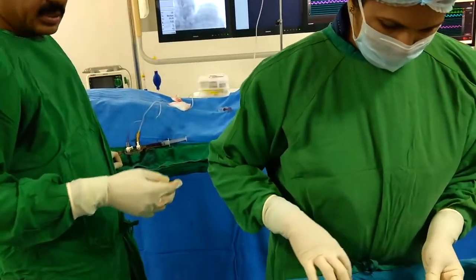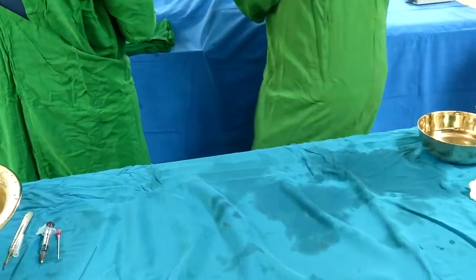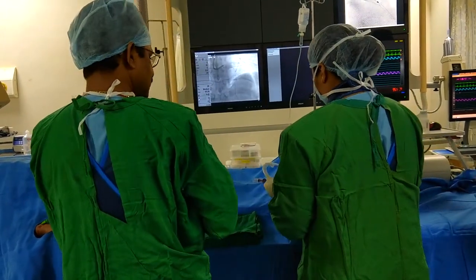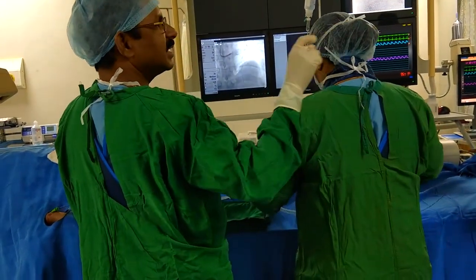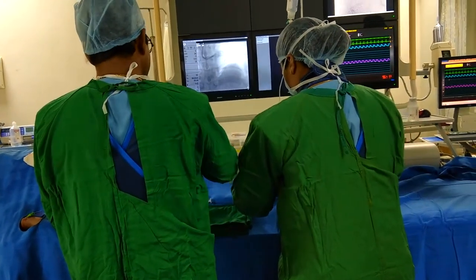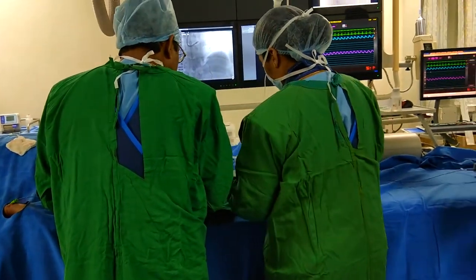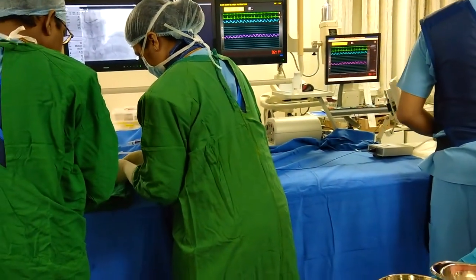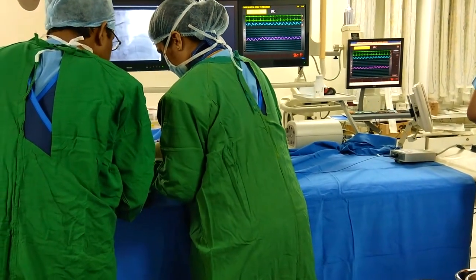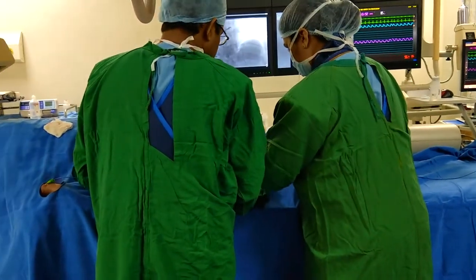We are preparing to introduce the IVUS catheter through the guide wire, which is placed in the left anterior descending artery at the distal level. Generally, the intravascular ultrasound catheter does not need any preparation — particularly, it does not need any aspiration. We can use it directly through the guide wire.